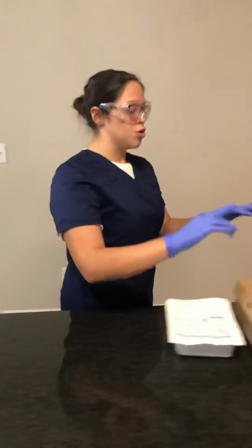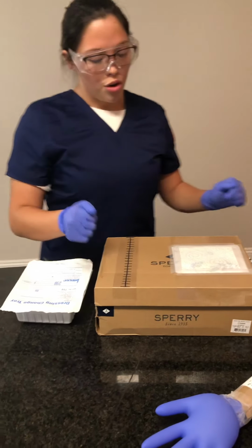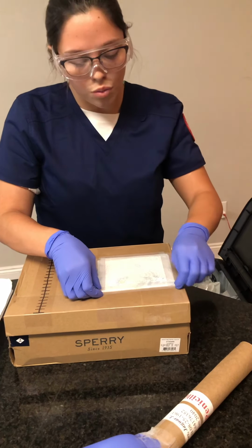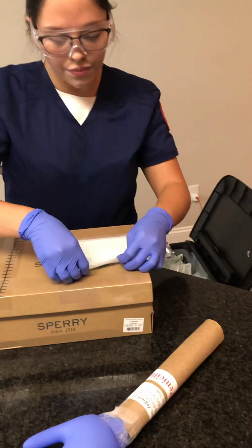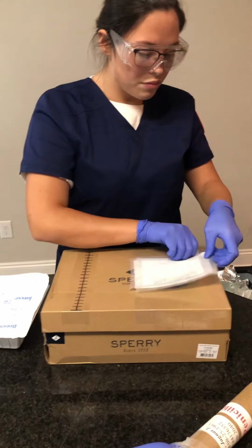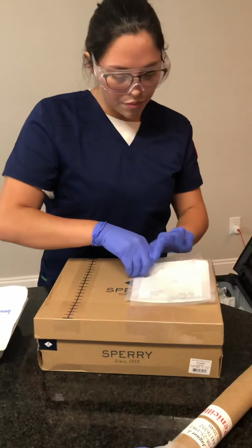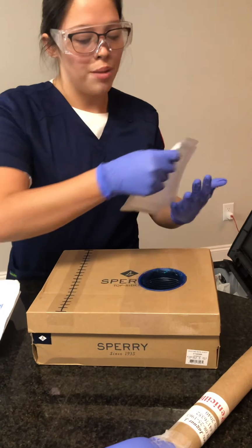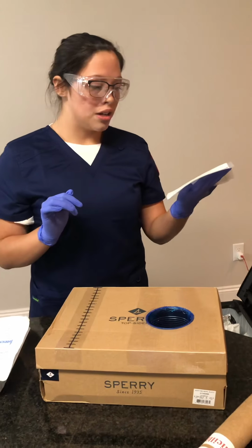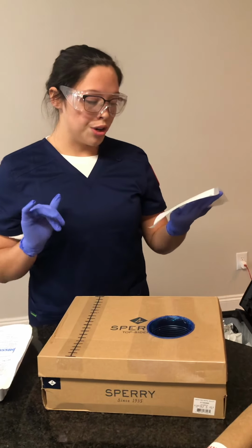I will then expose the dressing, as well as maintaining privacy. I will then remove the ABD pad, taking the tape off towards the wound. I will hold the ABD pad up and away from the patient. I will then assess the drainage on the ABD pad for the type, the amount, the color, the consistency, and the odor.